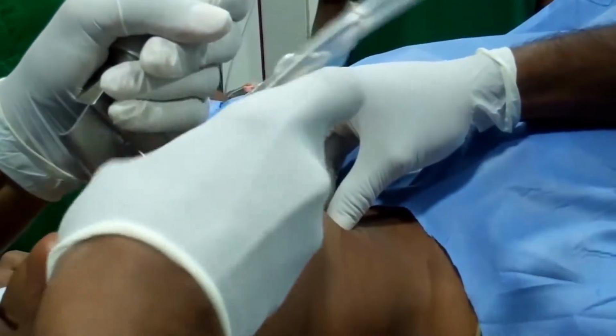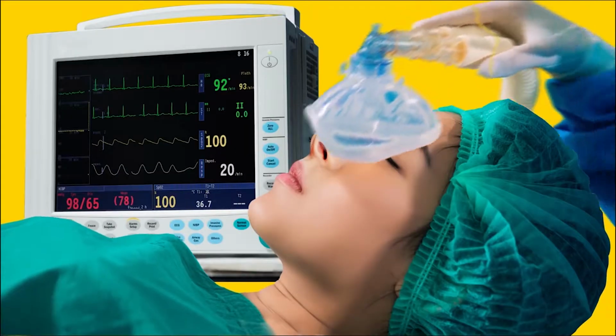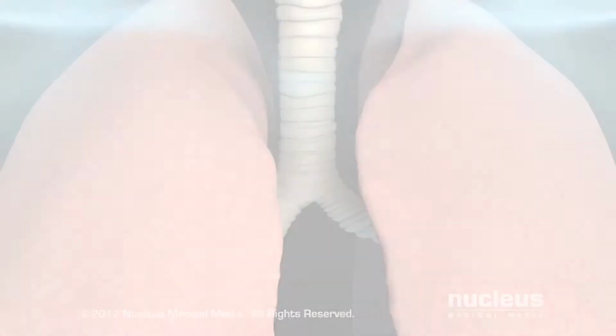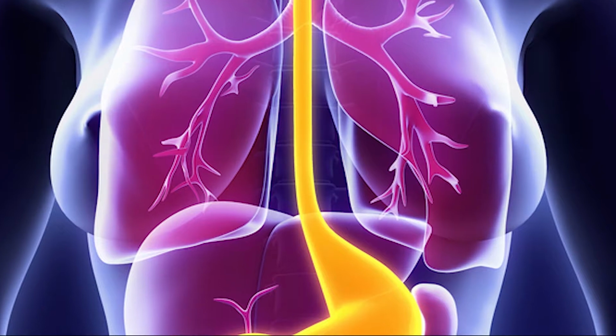Every major surgery begins with a successful endotracheal intubation done by the anesthetist. Within the first few golden seconds after intubation, the anesthetist needs to quickly confirm whether the endotracheal tube has been properly intubated into the trachea or has been misplaced into the esophagus. A misplaced endotracheal tube can prove fatal to the patient if not diagnosed and corrected immediately.